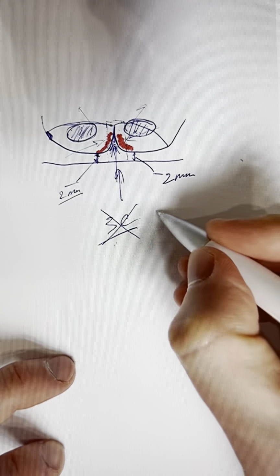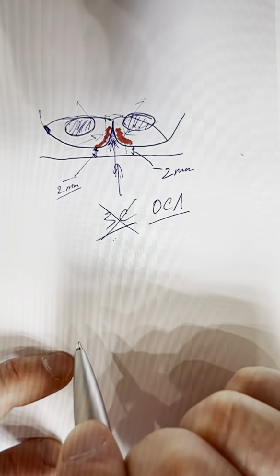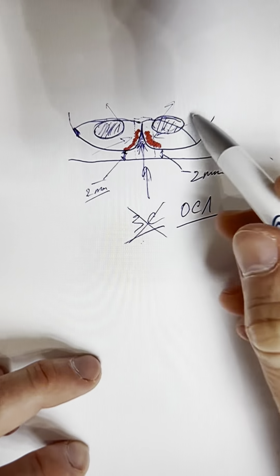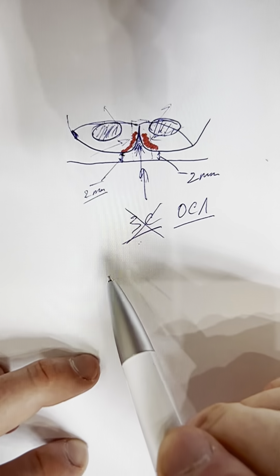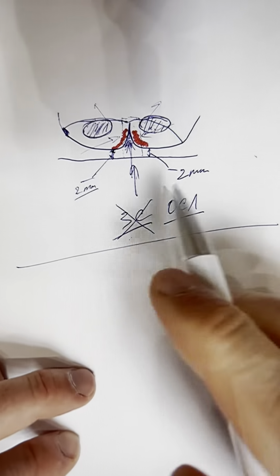So instead of closed sinus lift, you will have to perform the lateral sinus lift. This is fundamentally important. There is no other way to achieve success. I think this analysis should be useful to you because you should have learned a lot from this case.